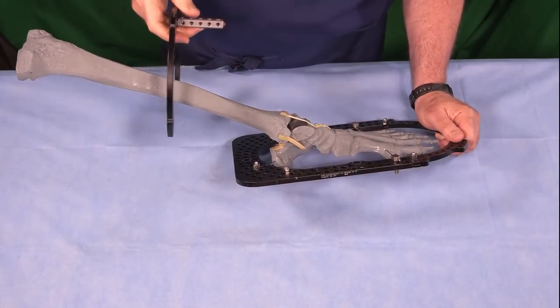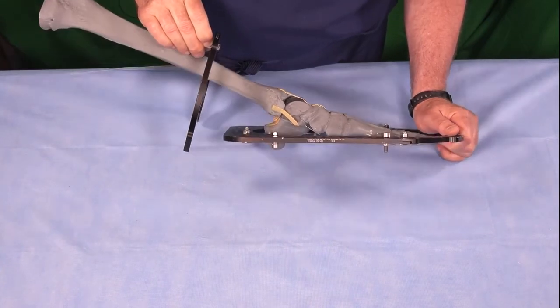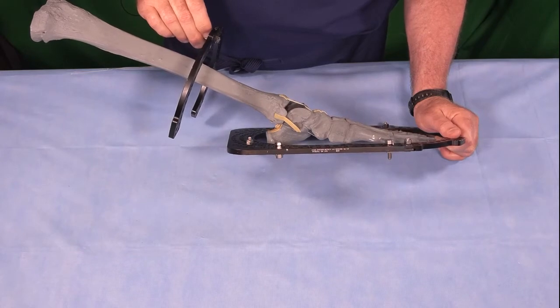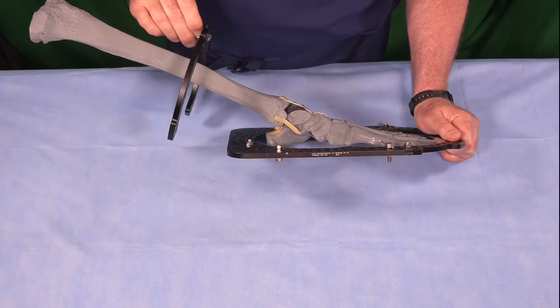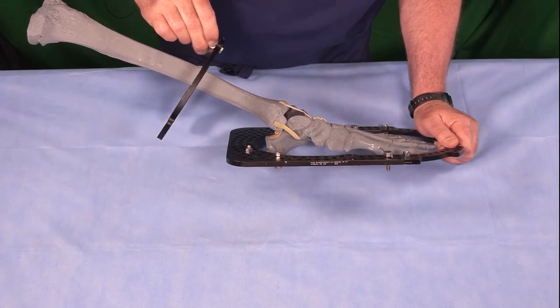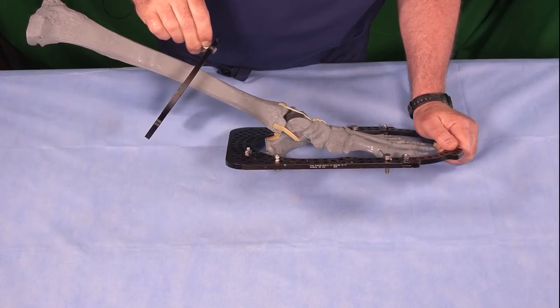And I'll put a 2/3 ring on here, and normally this is put on perpendicular to each segment. So just like the foot ring is perpendicular to the foot segment, the tibial ring should ideally be perpendicular. But as you'll see in this construct, we're almost at 90-degree angles to each other, and that's biomechanically disadvantageous for the hexapod system. We'll get a stronger mechanical push if our rings are a little more parallel to each other at this point. That means that when we finish, they won't be parallel to each other.